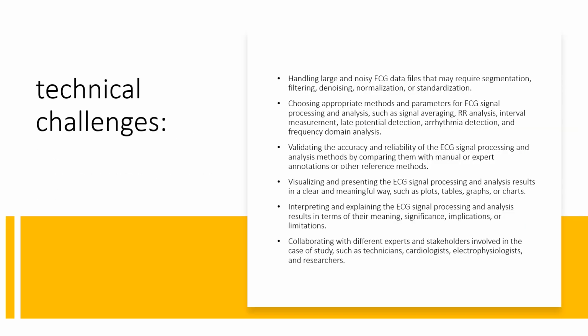Problem statement. Technical challenges. Handling large and noisy ECG data files that may require segmentation, filtering, denoising, normalization, or standardization. Choosing appropriate methods and parameters for the ECG signal processing and analysis, such as signal averaging, RR analysis, interval measurements, late potential detection, arrhythmia detection, and frequency domain analysis.